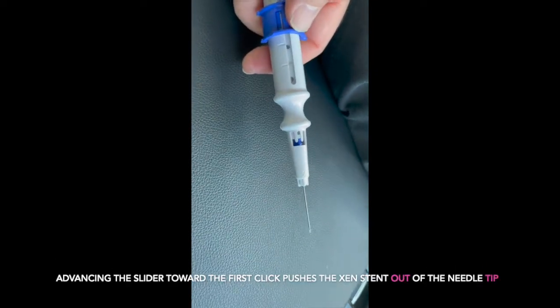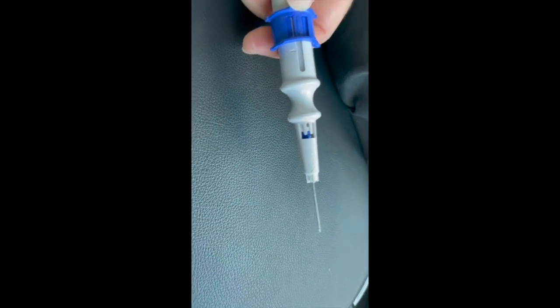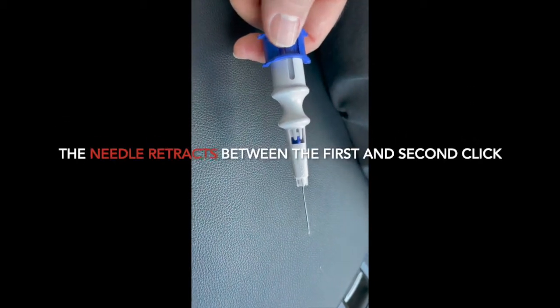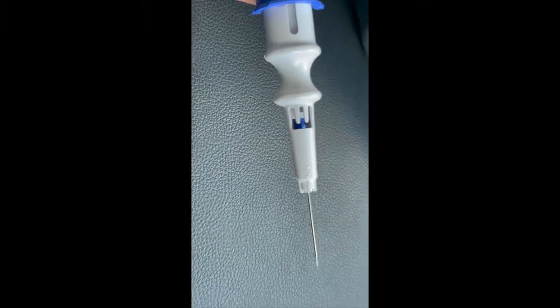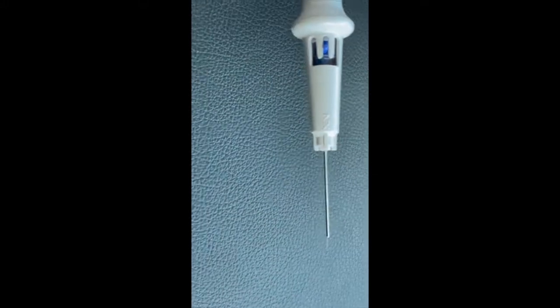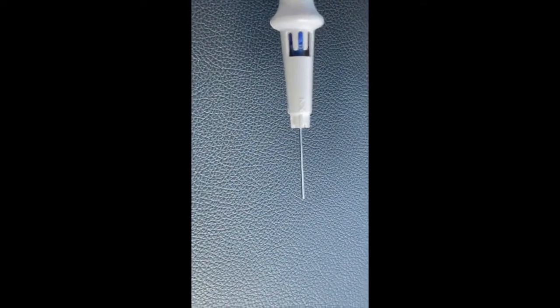When working with the device, it's important to remember that there are two clicks as you advance the slider forward. When you advance up to the first click, the device is injected out of the tip. After the first click and up towards the second click, the needle bevel is retracted. This is demonstrating moving between the first and second click, and you notice how the needle is retracted.